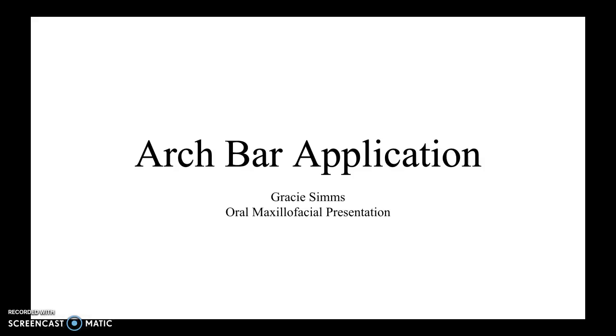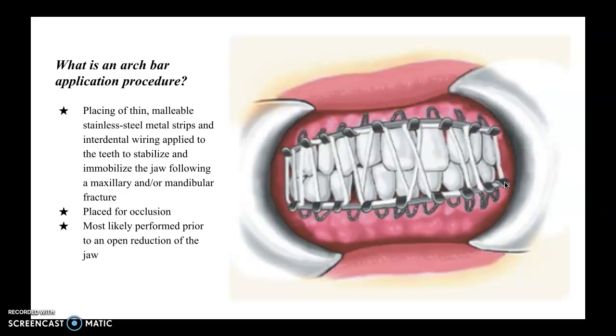Hello, this is my oral maxillofacial presentation on an arch bar application procedure. So what is an arch bar application procedure?